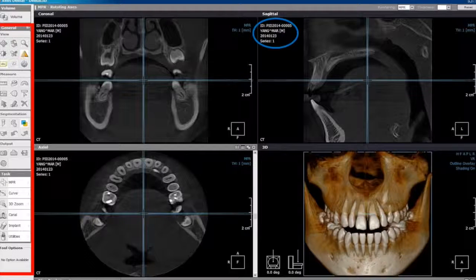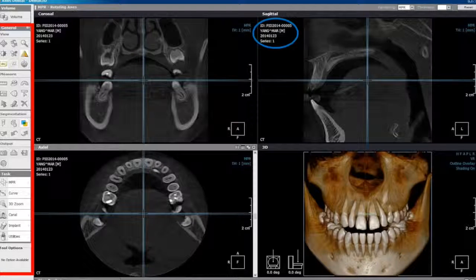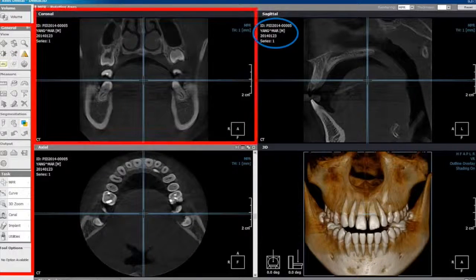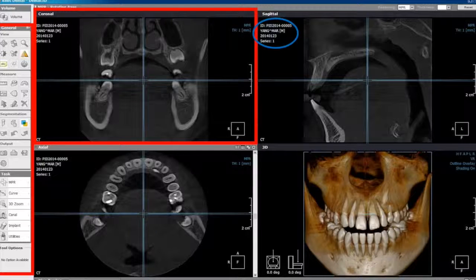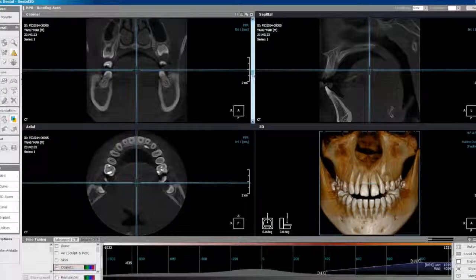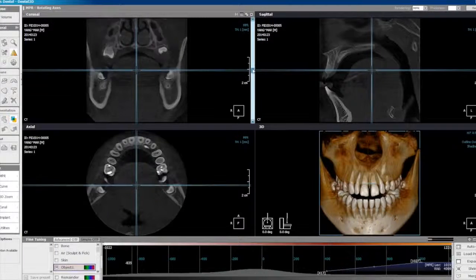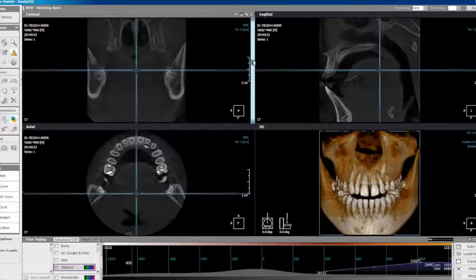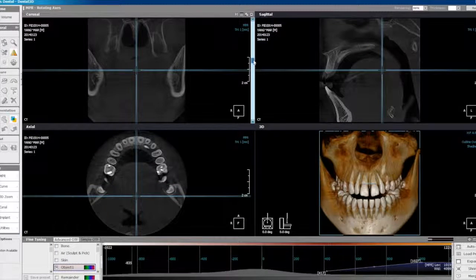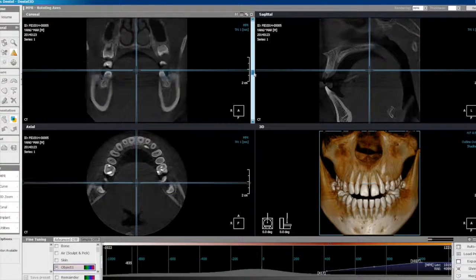Some tools provide additional information and a secondary panel when drop-down arrows are selected. Coronal plane displays a cut through the anatomy from ear to ear, and separates the anterior from the posterior. The view can be adjusted by moving the control points in either of the other MPR views.